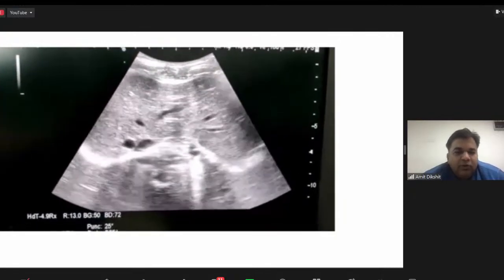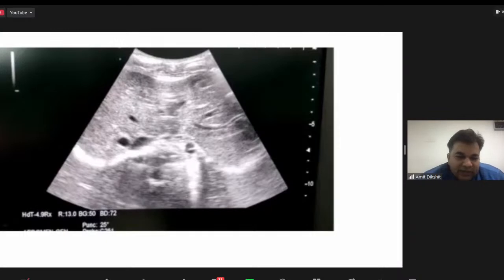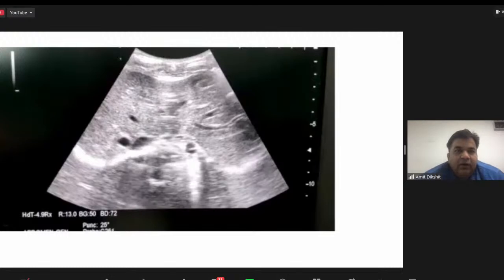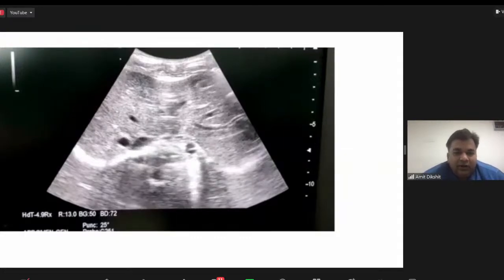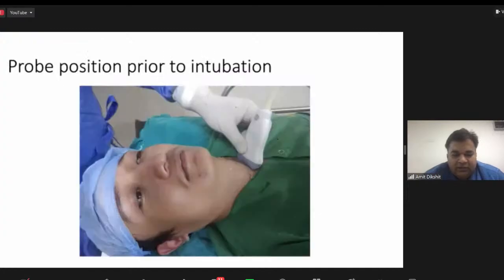I have spoken about intubation, how to choose the size of the tube by looking at the tracheal diameter in the subglottic area. I have said how to detect endobronchial intubation in long axis view. And we have also seen the importance of the esophagus, and where to park the probe. This is in pediatric patients and anywhere where you can see the esophagus and trachea together.